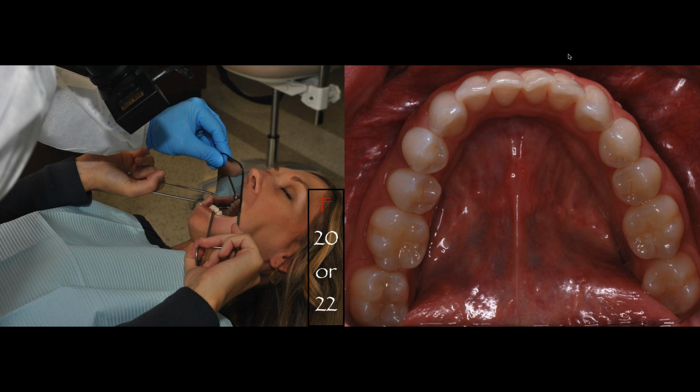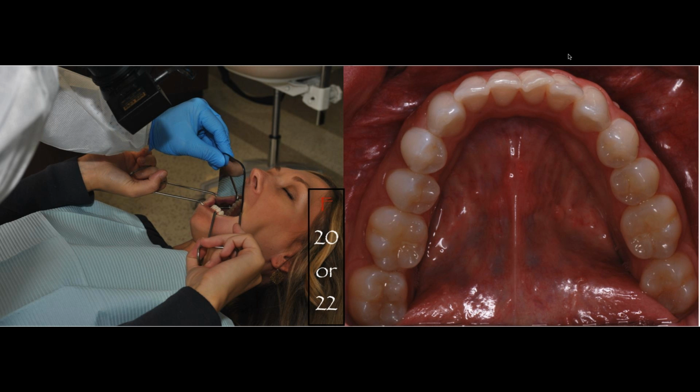Look at the photo. Look how dry that mouth is. Look how well the lips are retracted. I push the tongue all the way back. My mirror is actually seating distal to the second molars. That's how you take this photo. This is the technique and the way that you should place a mirror for this specific photo.